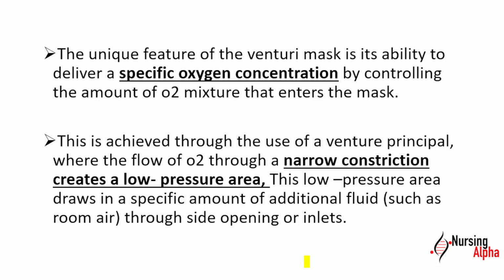Now we will see how it works, or what are the principles of the Venturi mask. The unique feature of the Venturi mask is its ability to deliver a specific oxygen concentration by controlling the amount of oxygen mixture that enters the mask. In a Venturi mask we can give a specific oxygen concentration to the patient.